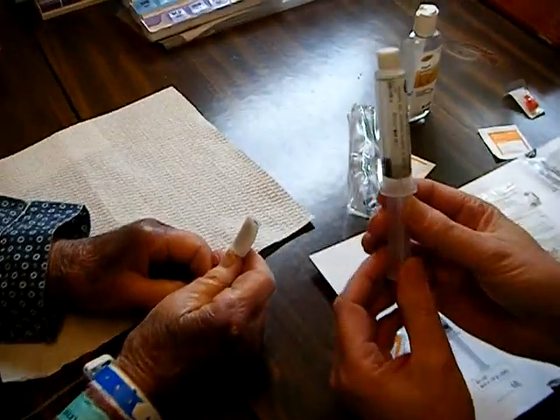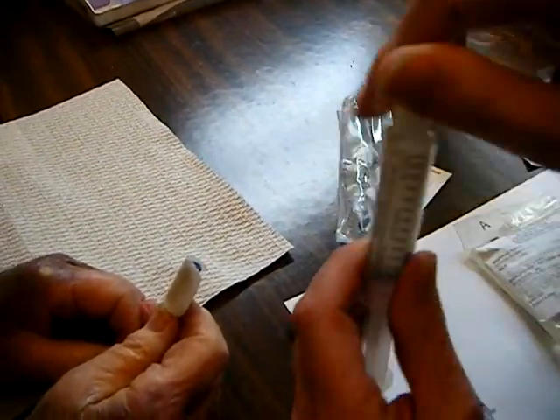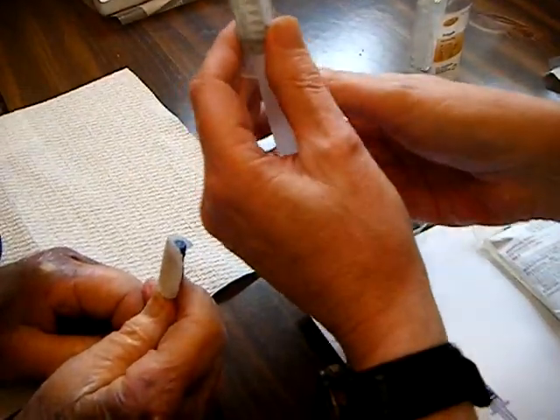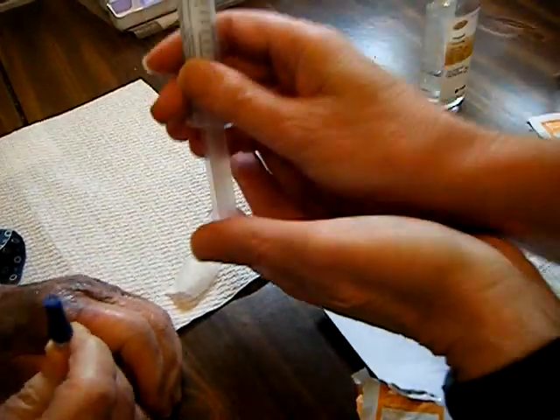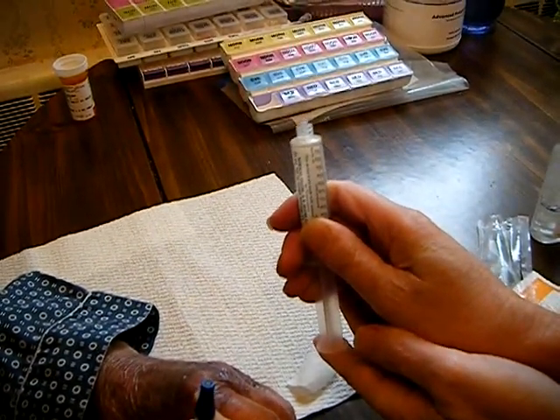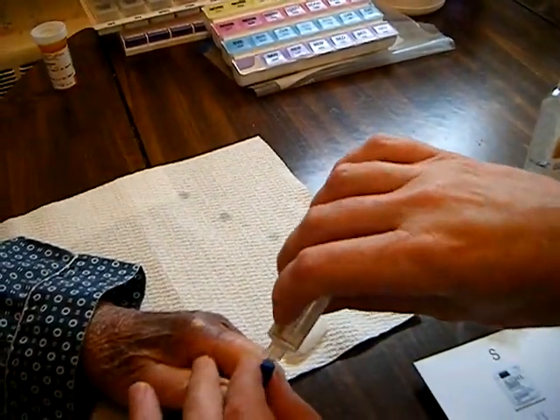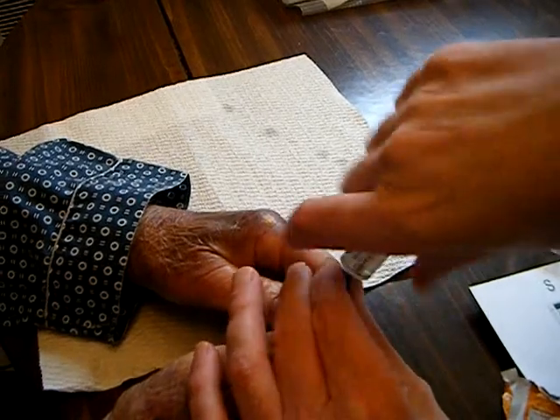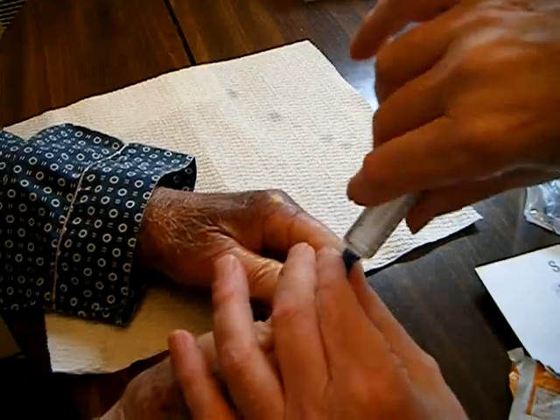Gerard, focus on this apparatus here. This is our syringe. The cap comes off quite easily. There's a tiny little bit of air in there, so all we need to do is push up on the syringe until you get the air out. You know you have the air out when you get a drop of water. That's a little bit too much water, but okay — we have the end sterile. And now our injector device screws on about a screw and a half.